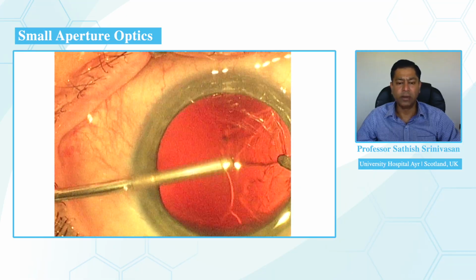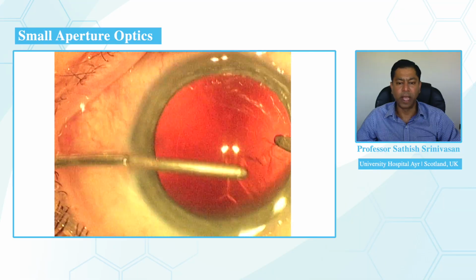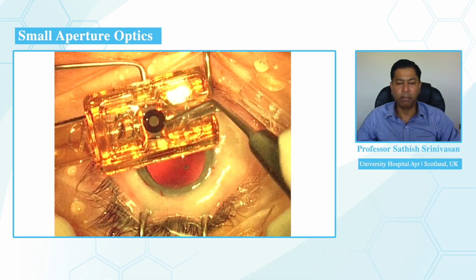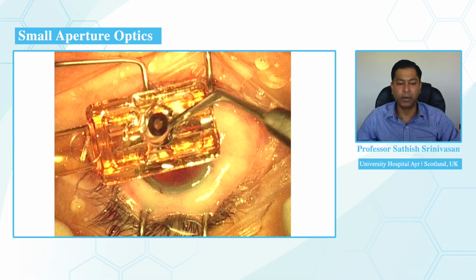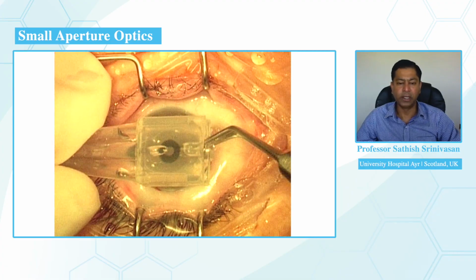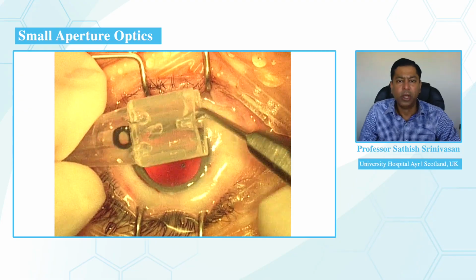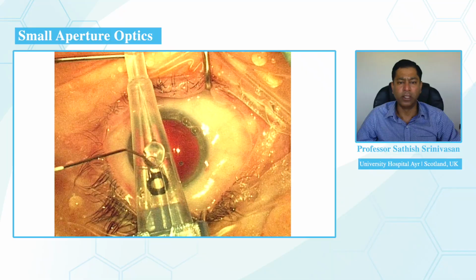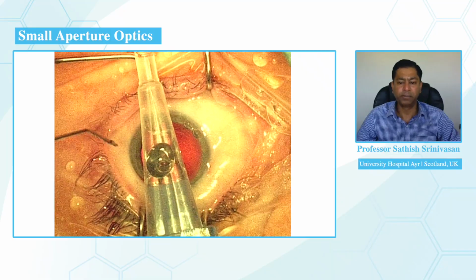This is the injector cartridge for the IC8. The IC8 is removed from the holding device and placed inside the custom-made cartridge, and OVD is injected into the nozzle of the cartridge to facilitate the smooth transition of the intraocular lens during the injection technique.